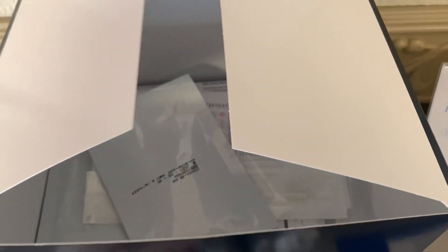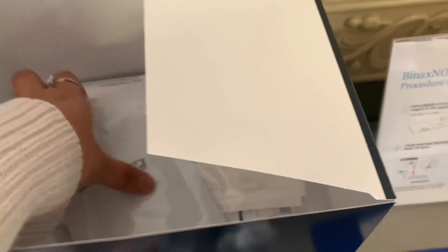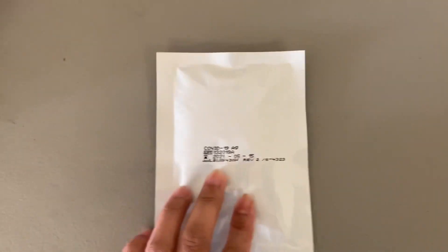Today you're going to learn how to use rapid COVID tests using Vinax. All you need is three things: the AG card, COVID reagent, and your nasal swab.